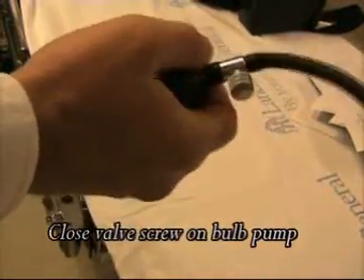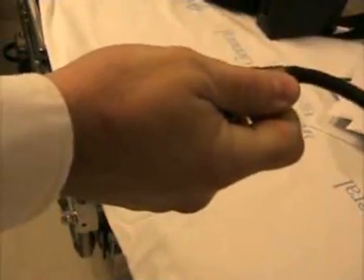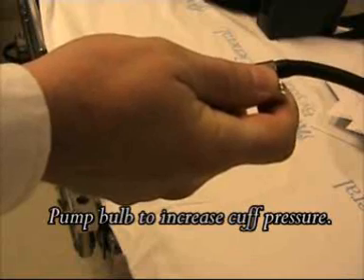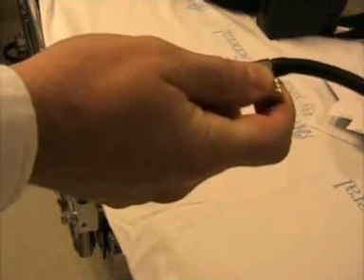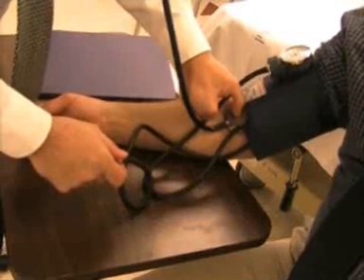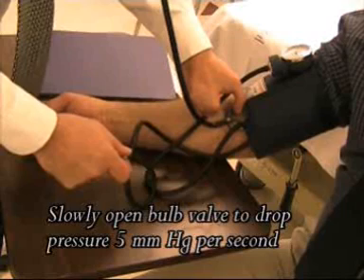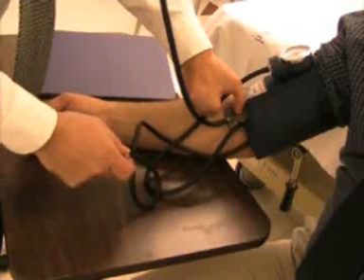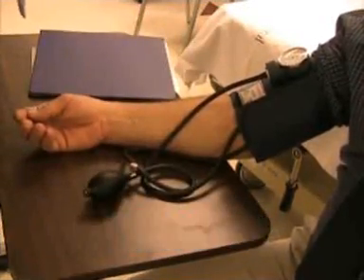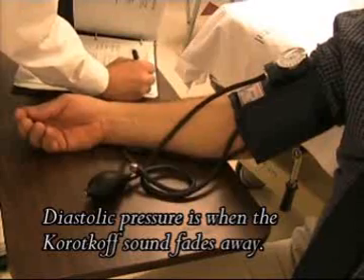Tighten the screw of the bulb and quickly pump the pressure up to above what the patient's normal pressure should have been, to about 160 millimeters of mercury. Loosen the screw and let the air out slowly as the gauge falls about 5 points a second. Carefully look at the gauge and listen for the sounds. Remember the number on the gauge where you first heard the thumping, and continue letting the air out until the thumping stops.